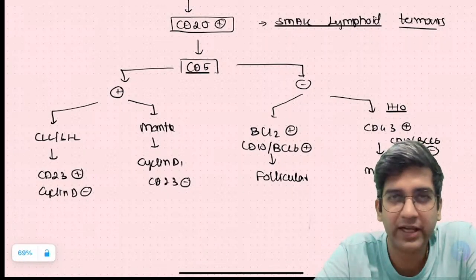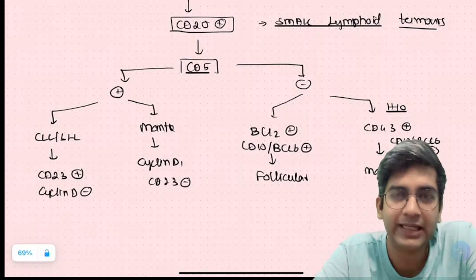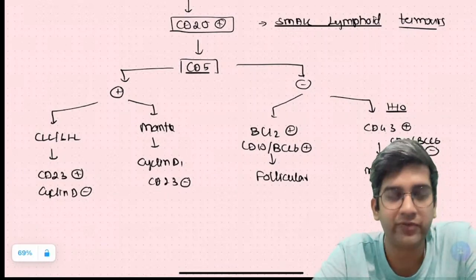So we have seen two cases today. One is a leukocytoclastic vasculitis. The other is a lymphoma. Let's see if time permits, I'll take a little bit more in detail some point of time with some other lymphomas. Hopefully we'll learn more together.